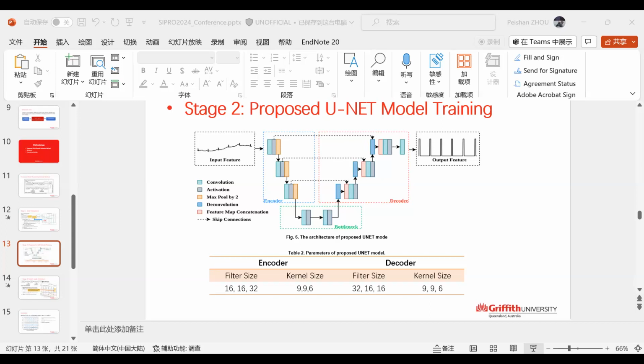So in this work, we use the Abdominal and Direct Fetal Electrocardiogram database. This is because it provides direct fetal ECG, which can be considered as an extracted fetal ECG from the mixture. The data also provides the R-peak annotations for 5 records from 5 different subjects, and each recording lasts for 5 minutes, sampled at 1 kHz.